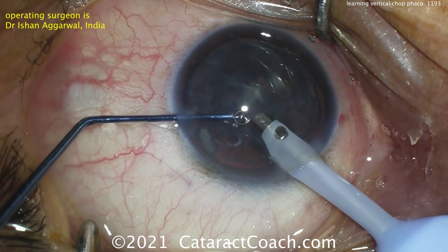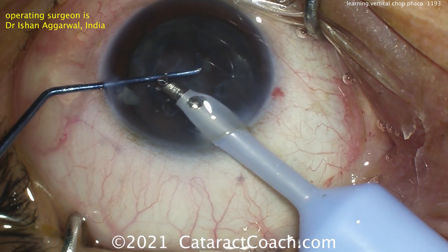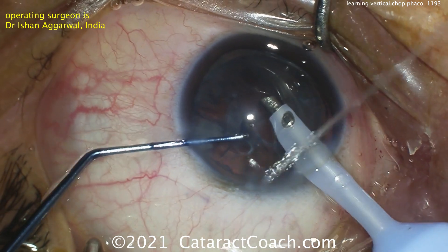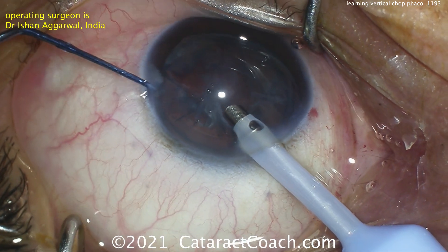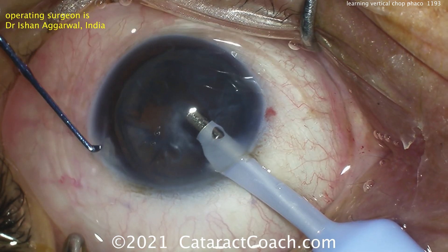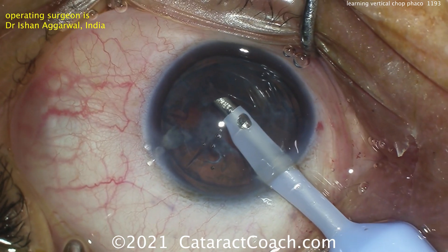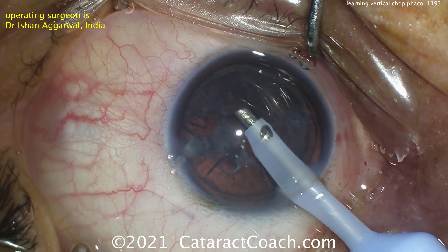The last bits are coming up and it looks like there's an epinuclear shell down there, which can be emulsified as well — that should come up pretty easily. The hydrodelineation was nice because it made that central dense endonucleus more manageable in size, and now the epinuclear shell can be aspirated out quite easily. The chopper is coming out — maybe it's a different instrument with a less sharp tip. Just using vacuum, you want to get that whole epinuclear shell out.